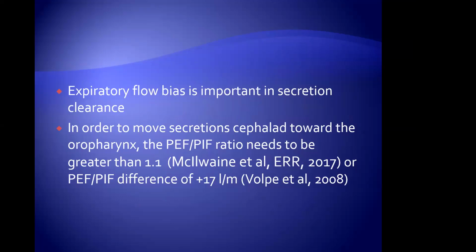So I'm not telling you anything you don't know or haven't read about. I'm just reinforcing that to make sure that when you're at the bedside and using your OPEP device, you encourage your patient to take that slow, deep breath in all the way and then hold it so we can get some alveolar recruitment, and then blast it out. So again, something we've done for years.